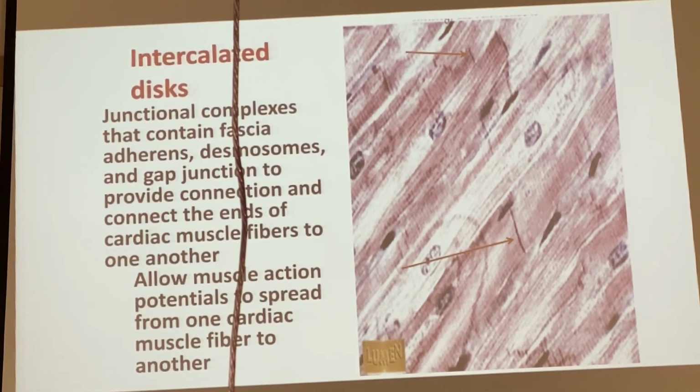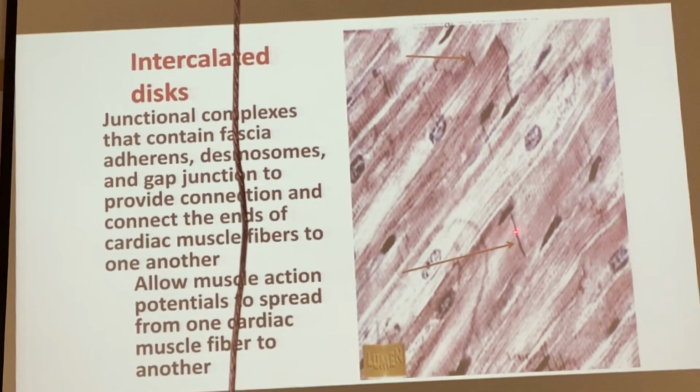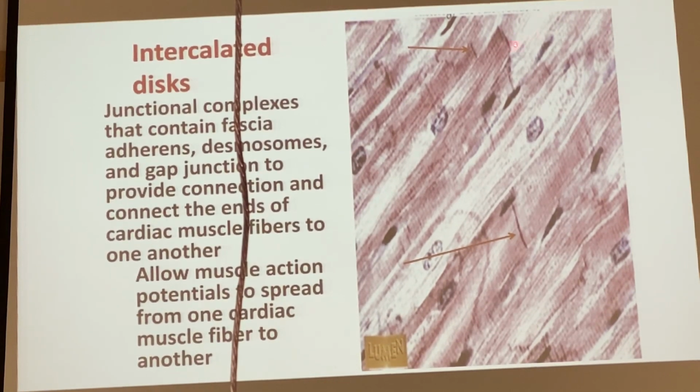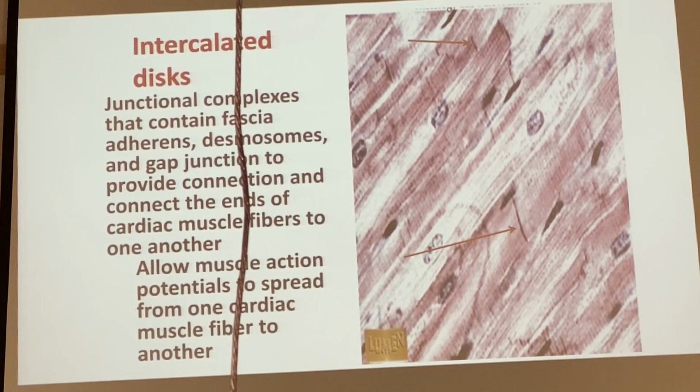Intercalated disc. This is the intercalated disc. Look at there. Intercalated disc. Very clear. Right?